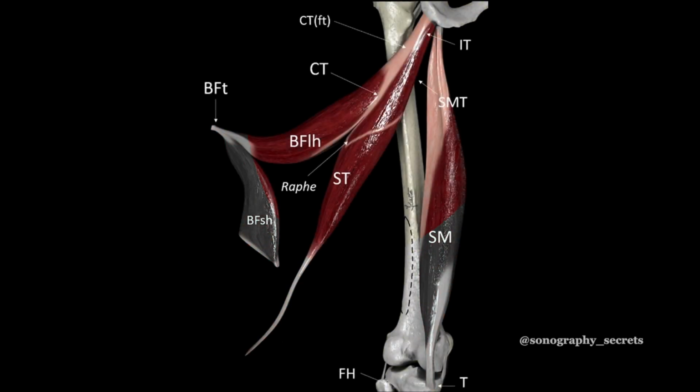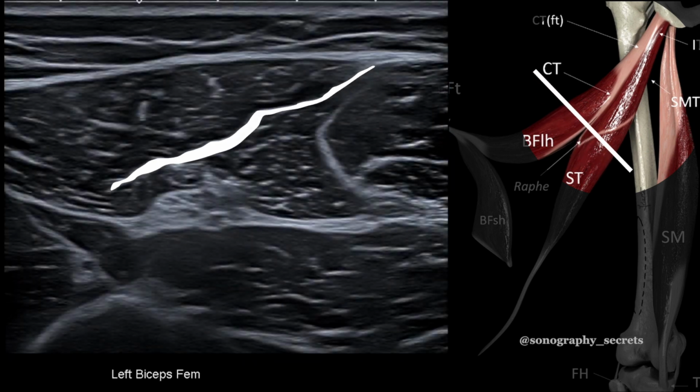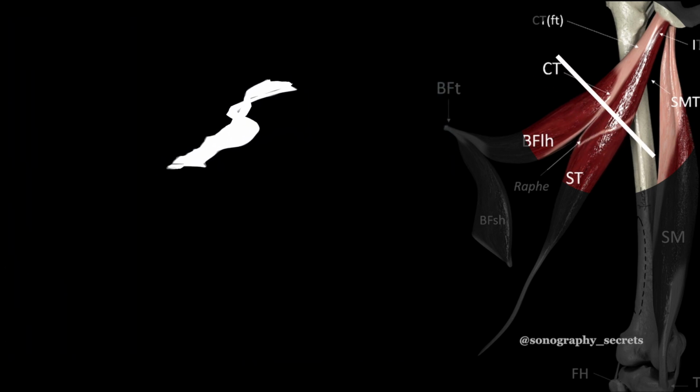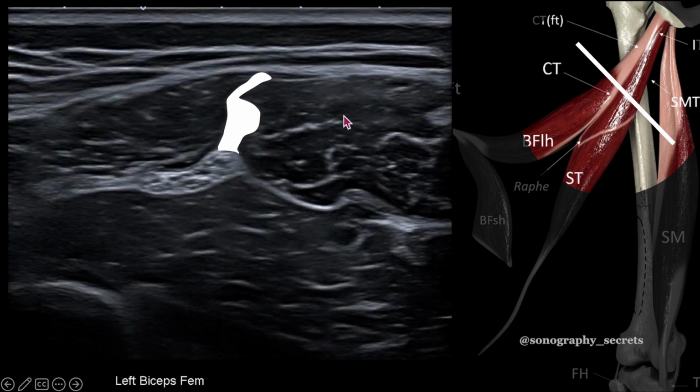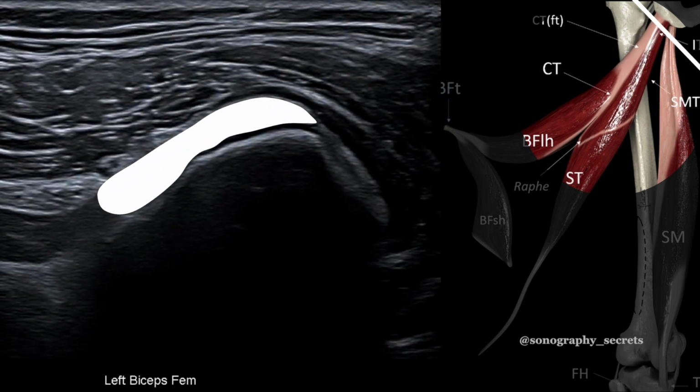From there, I'll move proximally and then look at the proximal aspect of the biceps femoris. So I start, it's quite a way down the hamstring, pick up the white bit again, and as I move forward, my eyes are on the white bit. We can start to see a contribution of fibers from semitendinosus, hence the conjoint tendon. And the conjoint tendon will insert or have its origin more medially and superficial than that of semimembranosus.